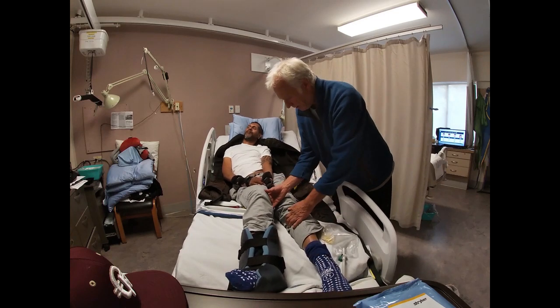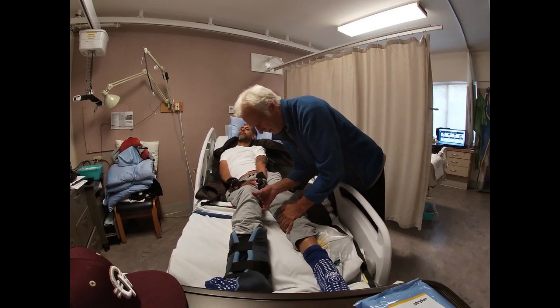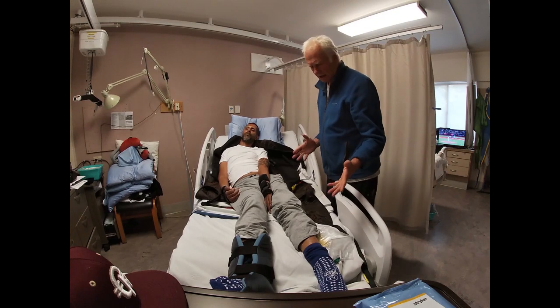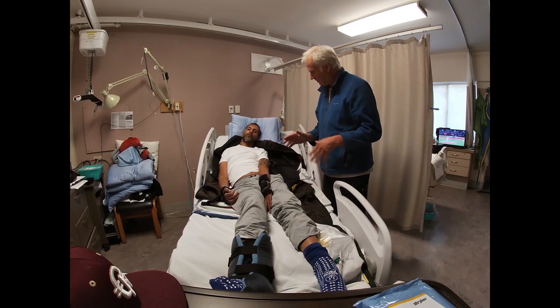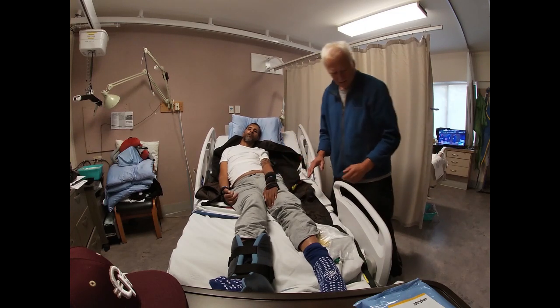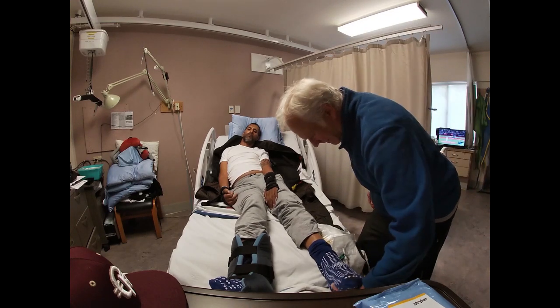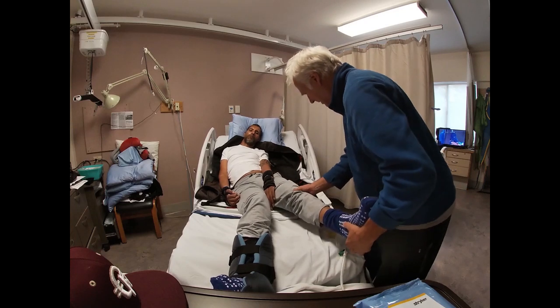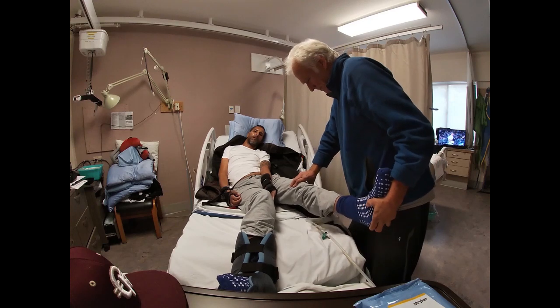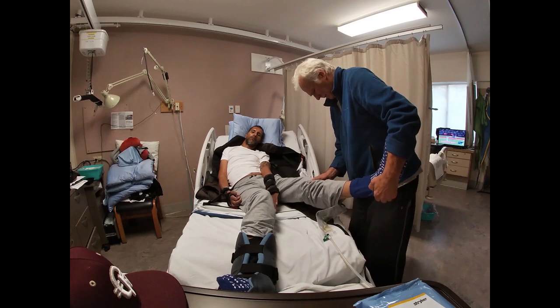So it seems like the problem here is in the legs, and it's pretty well impossible to get his legs apart like this. So what I'm going to do first is stretch out the legs a little bit, and then strap them to the side of the bed to reduce the amount of spasm, and then maybe we'll get some work here. Okay, so let's get this leg here. The left side is a little bit more spasmodic than the right. Just work with the hamstrings first here a little bit.